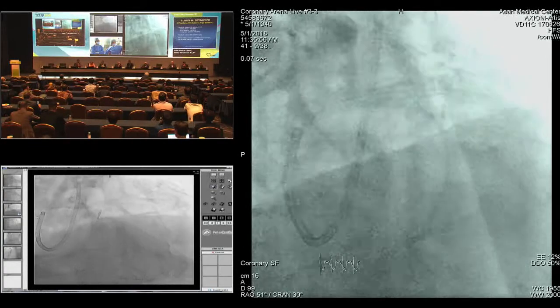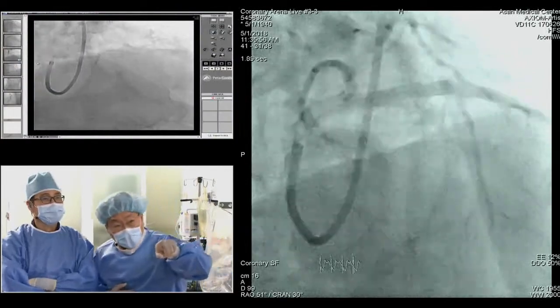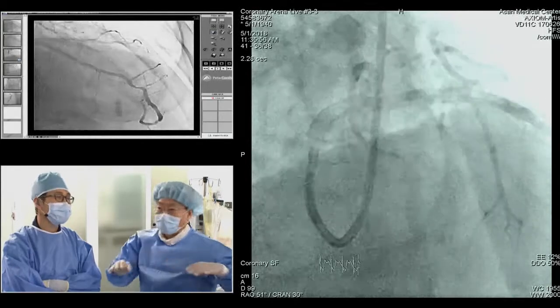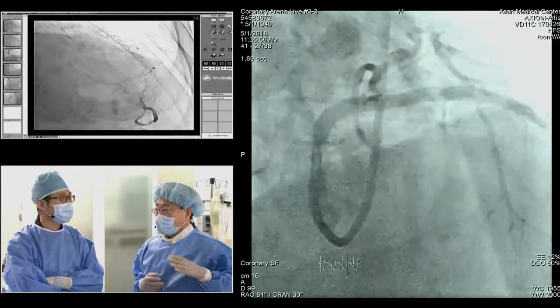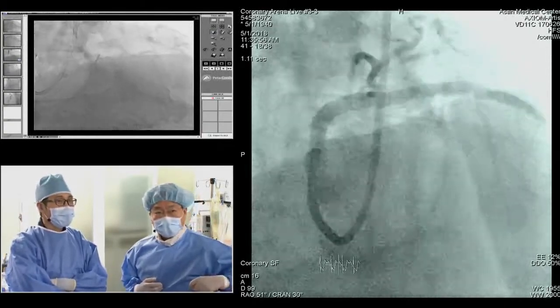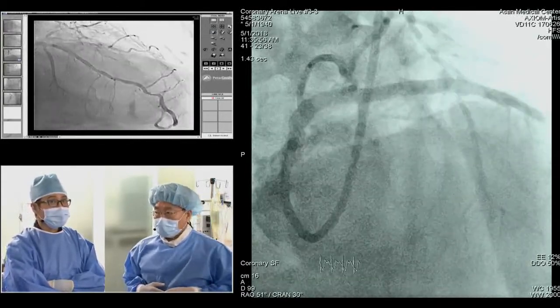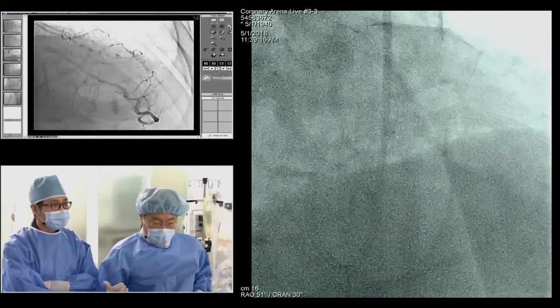No. Currently, the patient didn't feel too much chest pain. However, in terms of those conditions, I want to do just wire protection if possible. So I don't want to fix up the diagonal branches. You know that there is heavy calcification. I don't believe we know perfect things. And technically, it is very difficult to wire, even in wiring LAD, even in wiring diagonal branches. And so we do just the main procedure, LAD stenting. So there is benefit and losing point. And so, okay, I will wait for a while. So nitro please, and then.